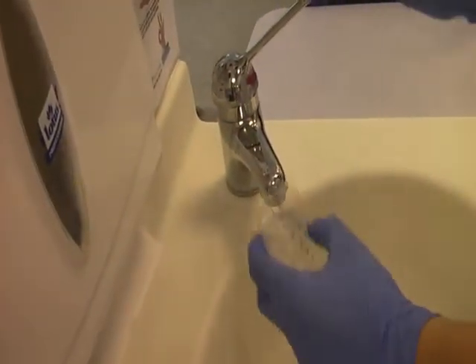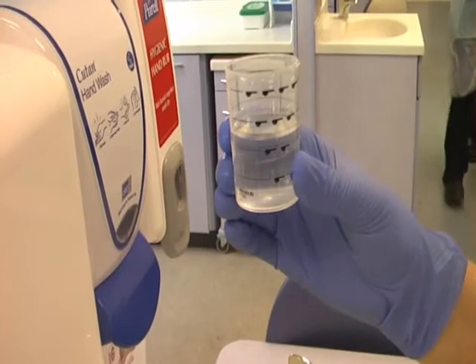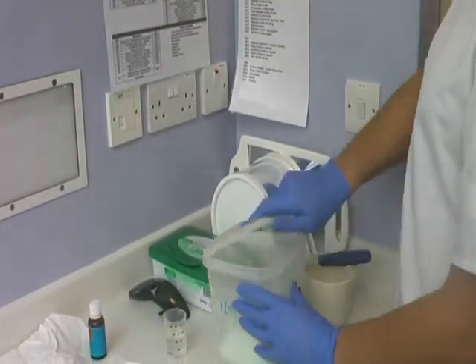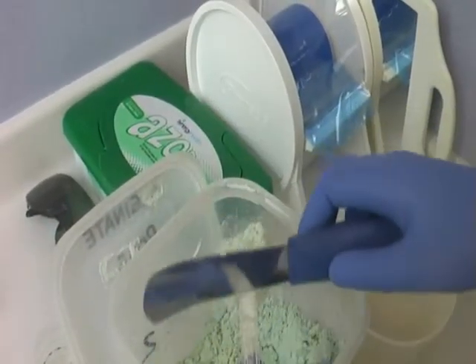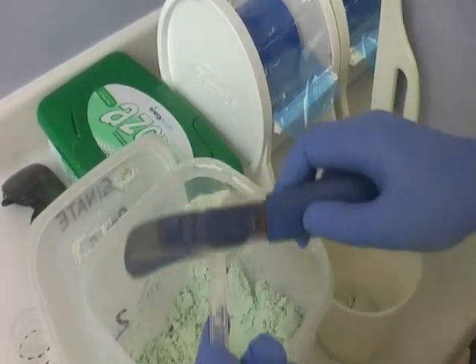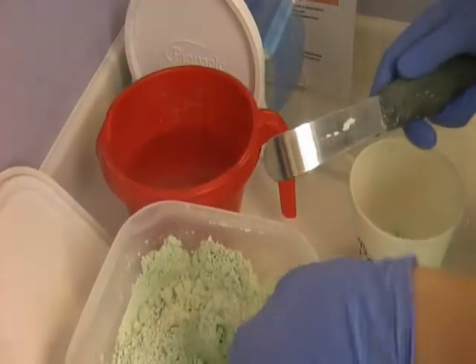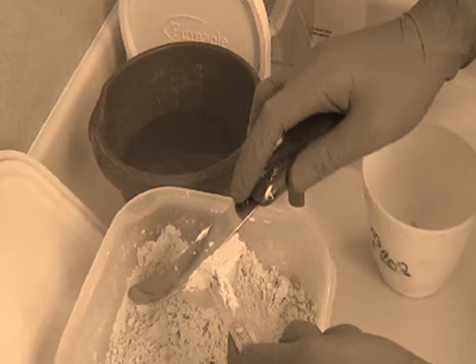Lukewarm water is measured according to manufacturer's instructions using the allocated measuring cup. Shake the container of alginate powder before starting as this will evenly distribute the constituents of the mixture. Measure out two scoops of alginate powder, leveling off the scoops using the alginate spatula. Replace the lid on the alginate box to make sure that it does not get water contaminated. Avoid condensing the alginate powder as this will change the properties of the material.